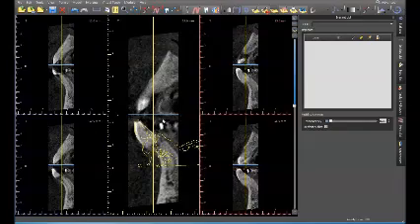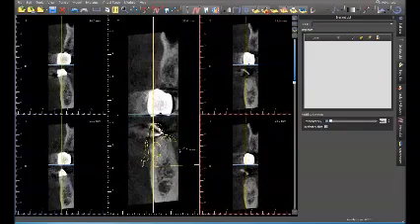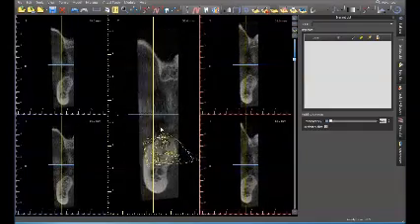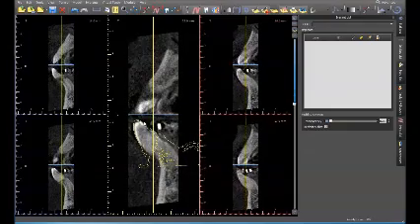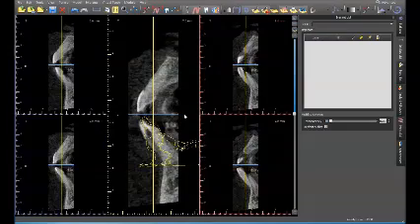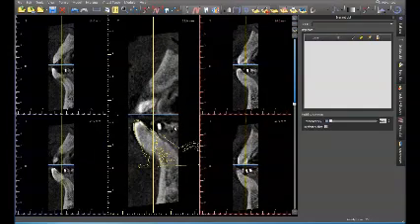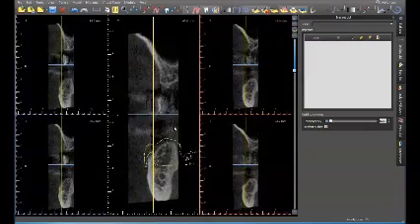It looks good in some of these views, but it looks pretty good here and here and there. Looks good there too. So you can see, I'm just looking at the overlay on these teeth and see how accurate it is. And it really does look good. It's a little off right here. That could be some beam hardening. For the most part, really not bad at all.